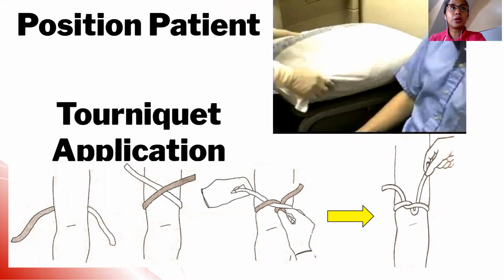So, class, first part is position your patient properly. Make sure they are comfortable. Tapos, position yourself properly rin. Make sure you're also comfortable. Practice phlebotomy and watch out for your posture. Kasi isipin mo, kung mag-phlebotomy ka ng ilang pasyente a day, tapos yung posture mo mali or very uncomfortable, class, ikaw rin yung kawawa by the end of the day. Okay, so position your patient well, position yourself as well.